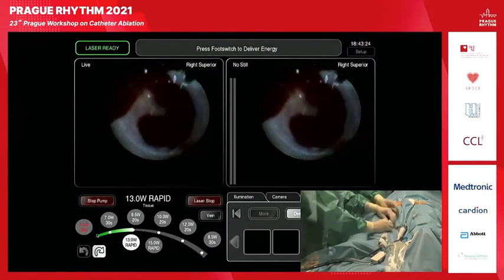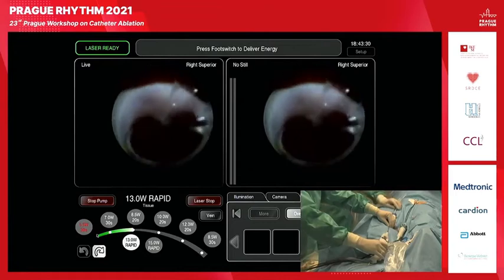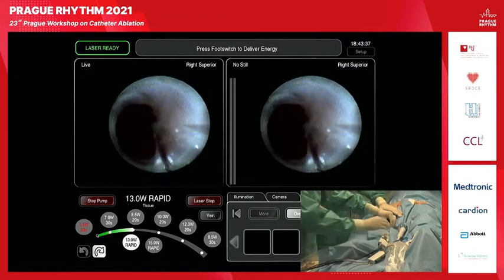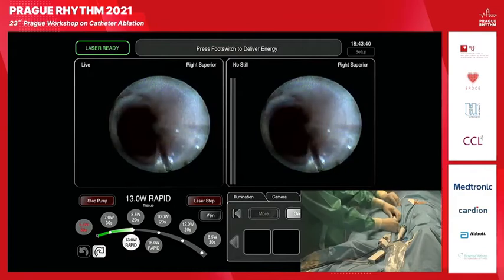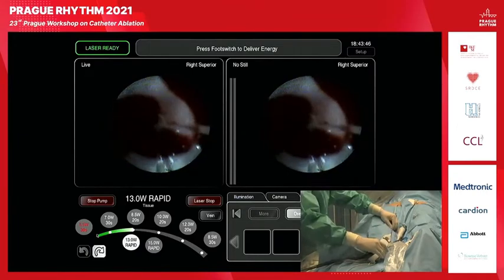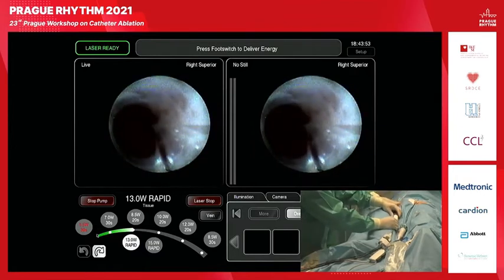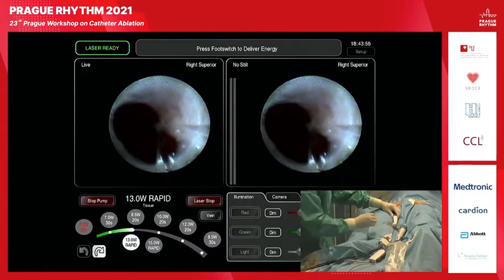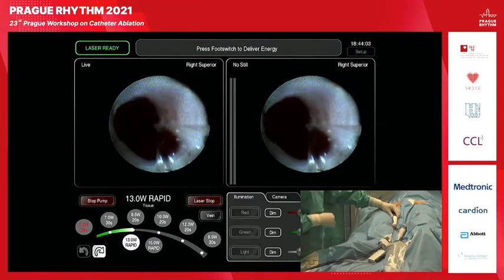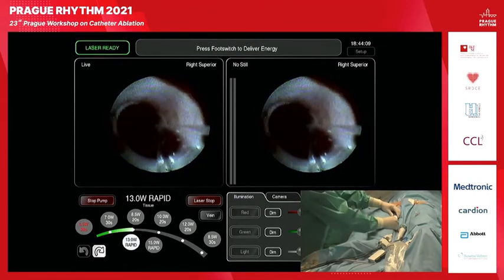To get ideal contact, we need to reach some kind of angulation, because angulation could help. The catheter itself is not deflectable, but we really play with the sheath, which helps us to manipulate and nicely orient the catheter itself. So right now, I would like to go with the sheath in the back of the laser balloon, and this kind of balloon is a little bit more robust than the classic Excalibur, which gives you more freedom to heat through the tissue. So I think, Honza, are you happy with this?